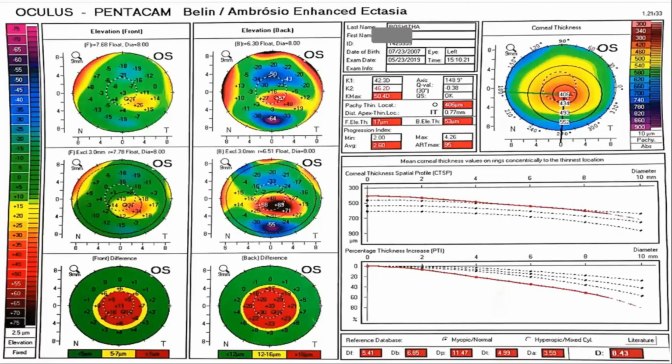You can talk a little about the settings also, like how you can change the reference surface or the scale, maybe with the help of the drop-down box where you can go and select. Yes, ma'am, sure. That can be a bit superficial, it's not that important.